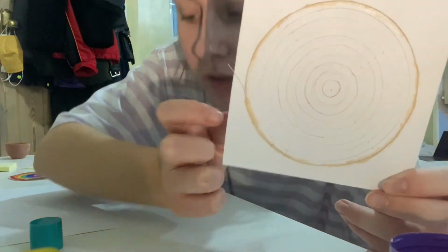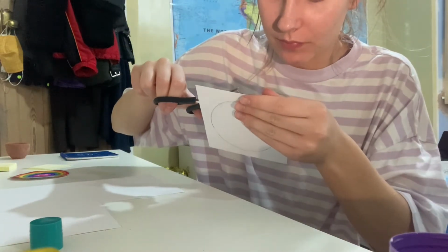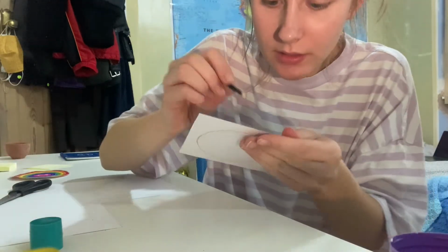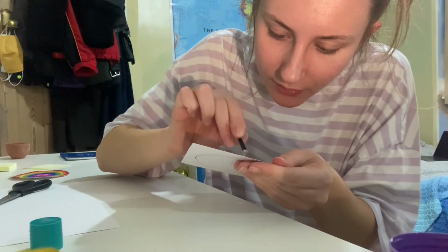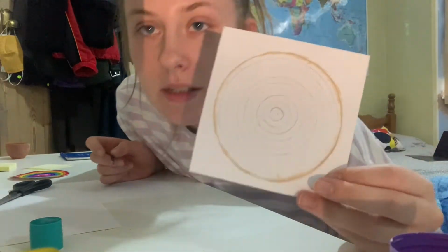You see I've got a little bit of extra here. It's because I just cut it a little bit extra just in case. So yeah, I'm just gonna cut that off there and then glue the tail end down. And yeah, it didn't take me too long.